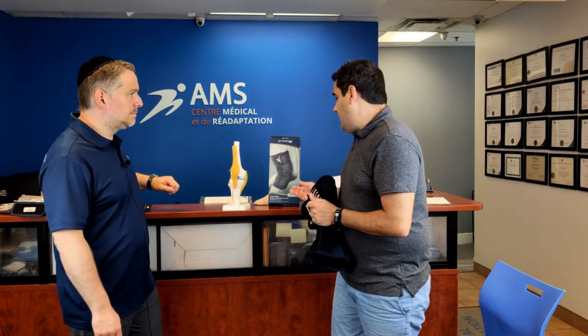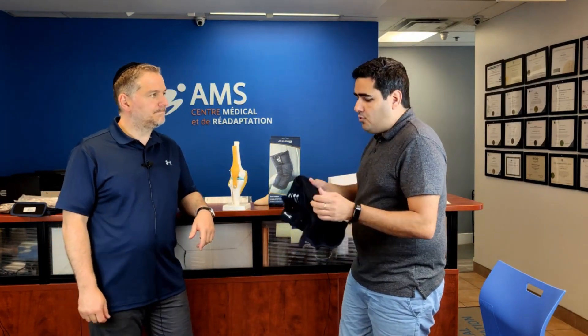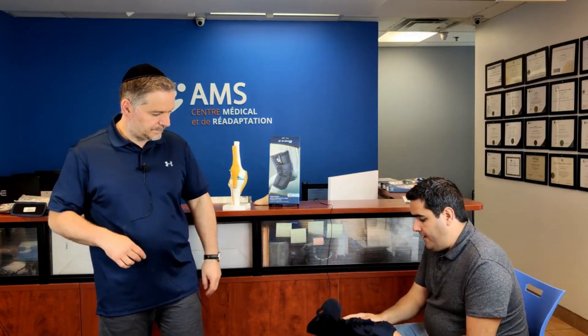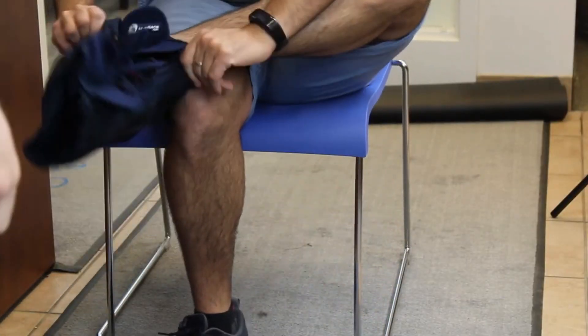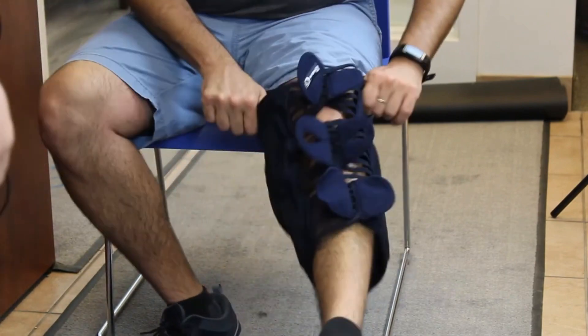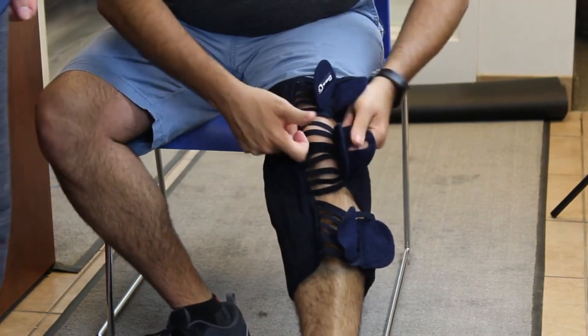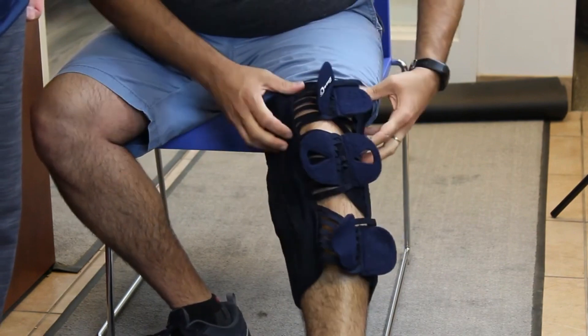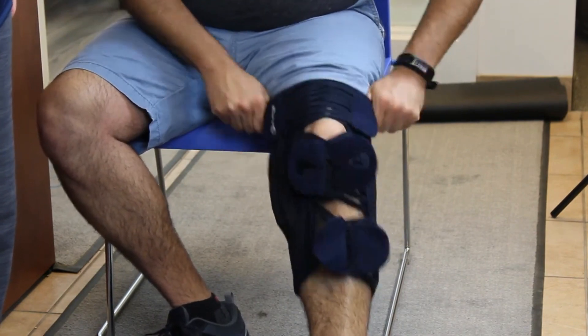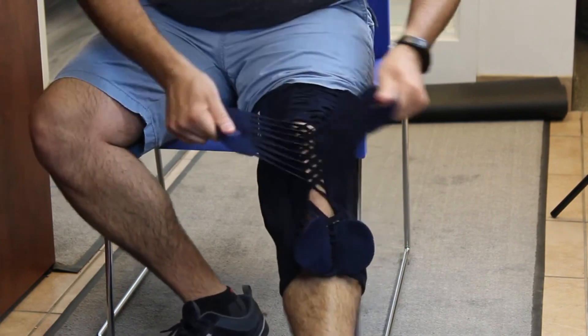Like M-Brace ankle braces, this is a 2-for-1. It's bilateral, and putting it on is really simple — it's like putting on a sock or pants. You just pull it on. There are two silicone straps on the sides that go right around the kneecap.